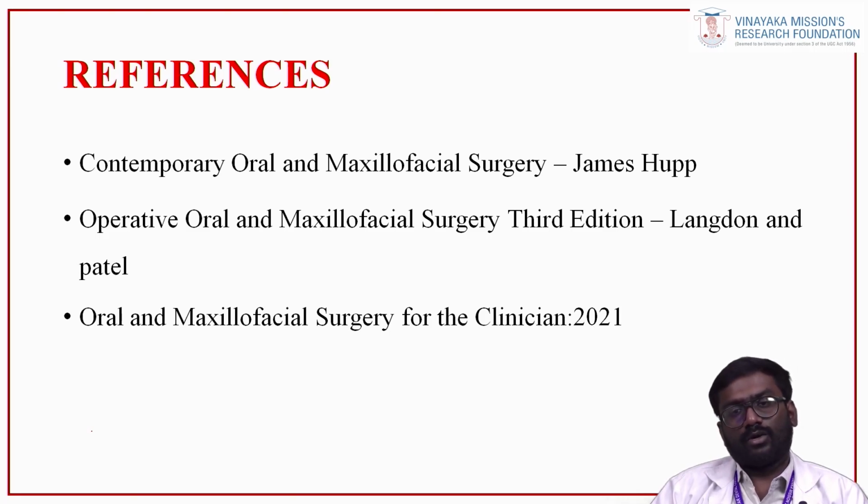Followed by that, you can do a GBR: you can fill it with graft, put a collagen membrane, re-drape the soft tissue and meticulously close it. And post-operatively, you have to follow up.